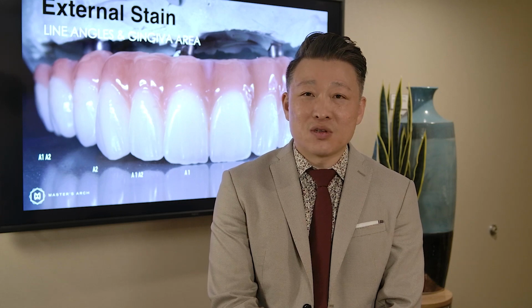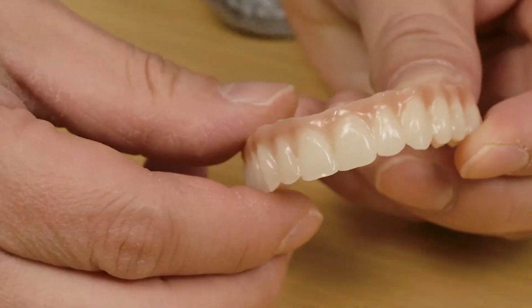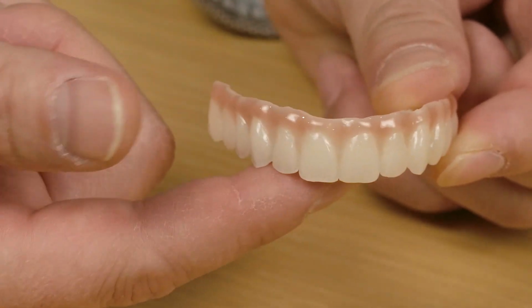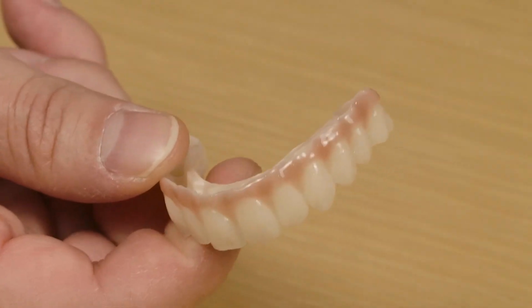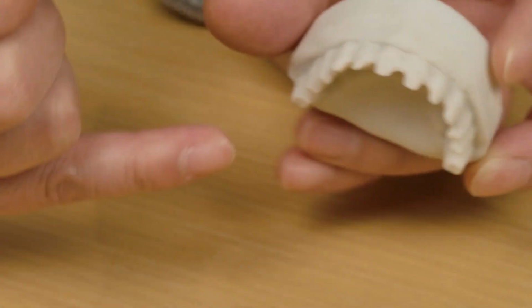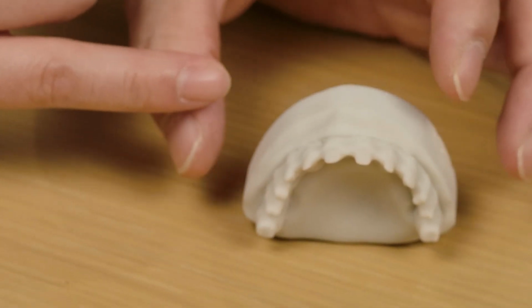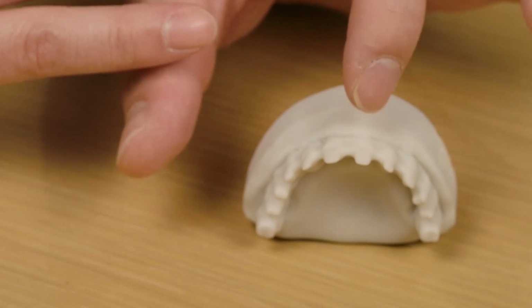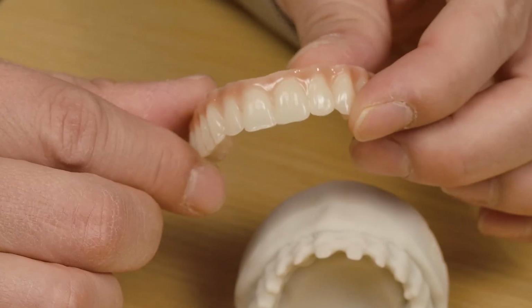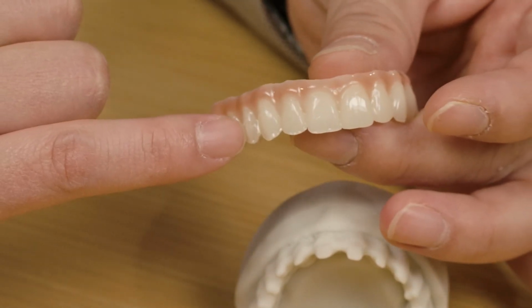So now I'm ready to show you my actual product, my actual results. So here's a full arch bridge as a superstructure. Note, STML Katana is only available if I'm using a substructure as a titanium bar. So I have a printed model that's showing my substructure titanium bar design. And while the milling center is milling my titanium bar, copy milling my design, I'm able to create this STML Katana Zirconia.